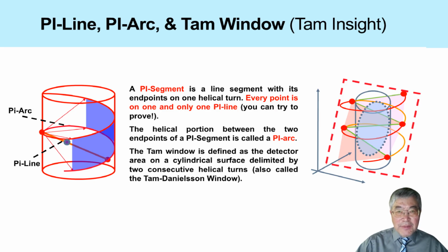But in real spiral cone beam CT, we do not have parallel beam projections. We have cone beam projections. So the question is, can we still get exact reconstruction? Here is the key heuristic argument.